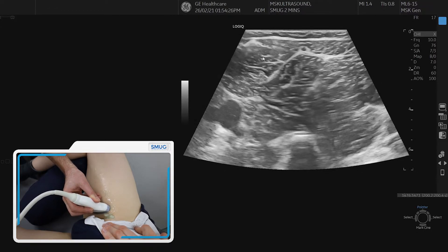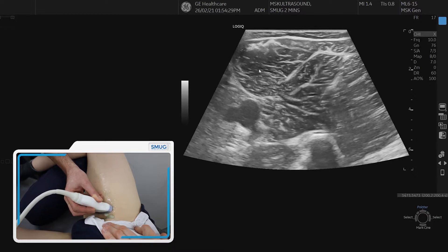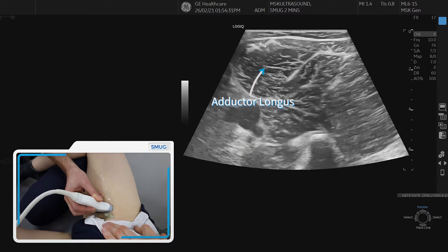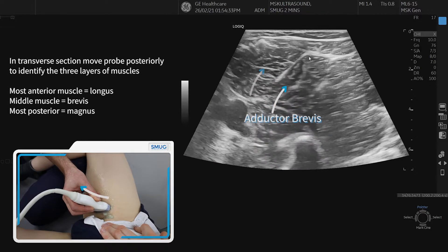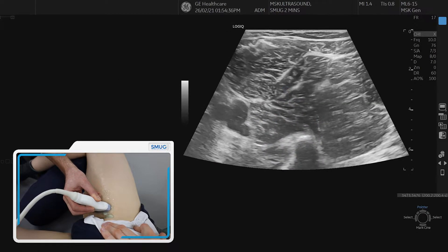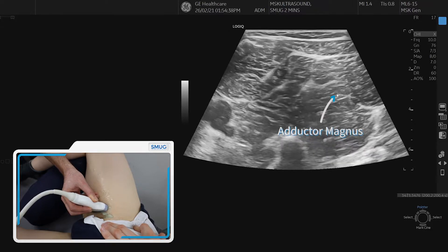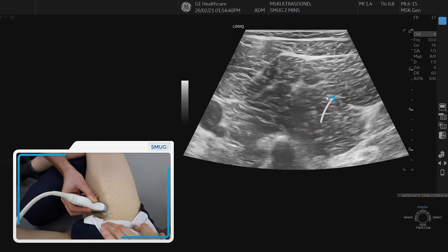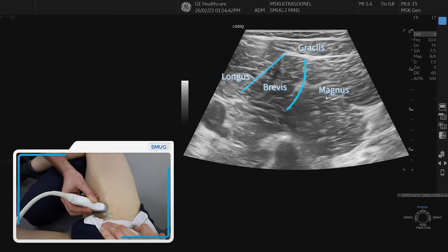Starting on the left hand side we've got the adductor longus, which has the adductor longus intramuscular tendon. Past the fascial plane we then see the adductor brevis muscle, and then to the right of that we see the adductor magnus, which is obviously a very large muscle.